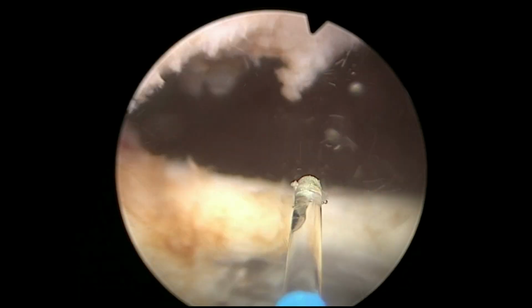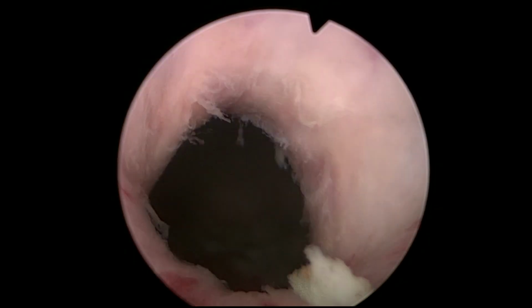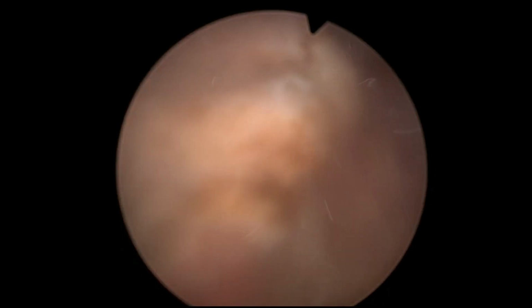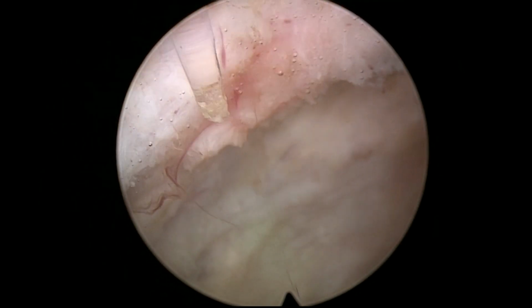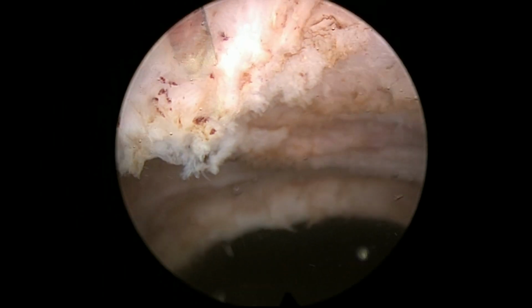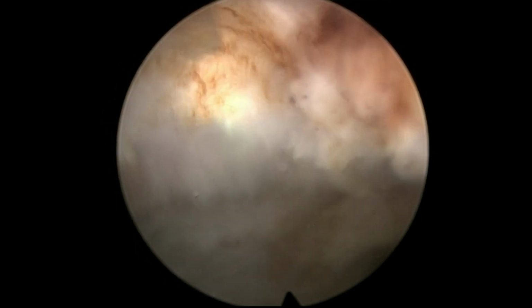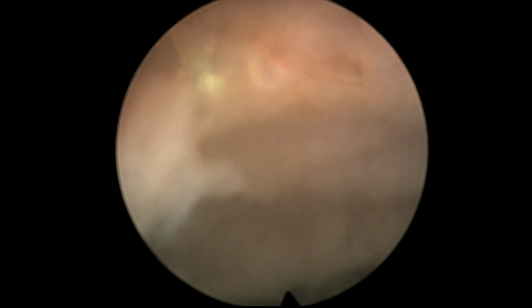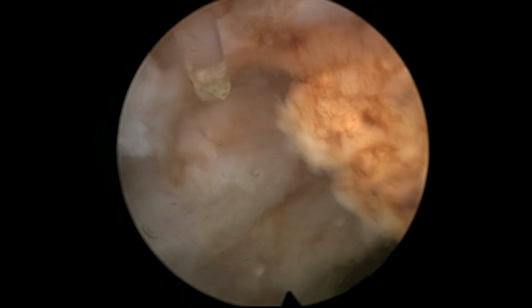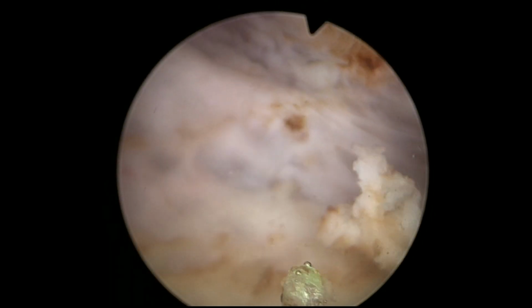The postoperative recovery is fast. You can do it in high-risk patients, and that's the final result. You can see the mucosa is very nicely preserved. That is the fossa again. Pretty regular and nice. And this is the trimming phase, the final phase. Here it looks as if I left a little bit of tissue, but again, with the anatomical information of the shape of the capsule and the cavity, you can tell we are not leaving major bumps.